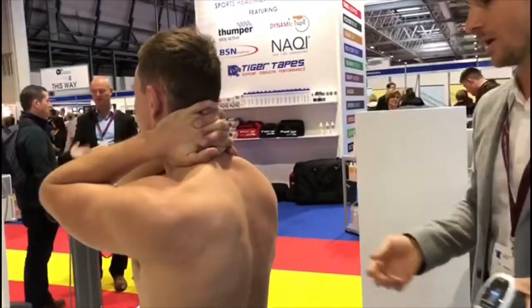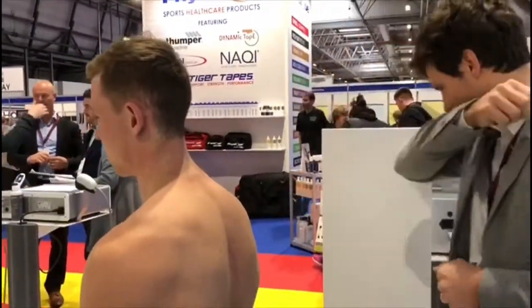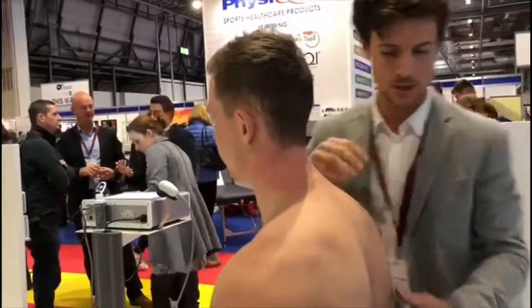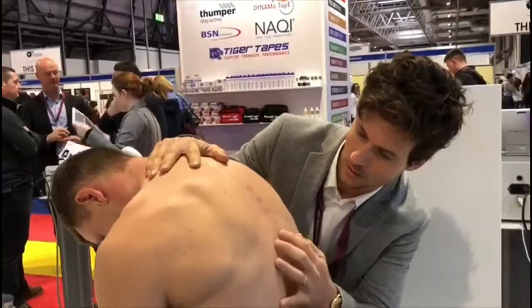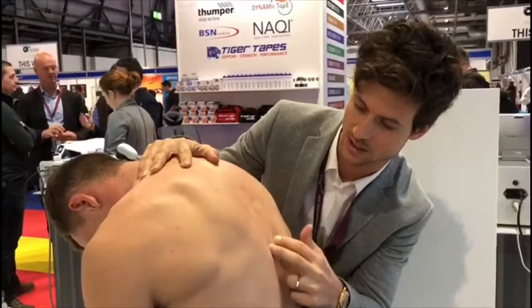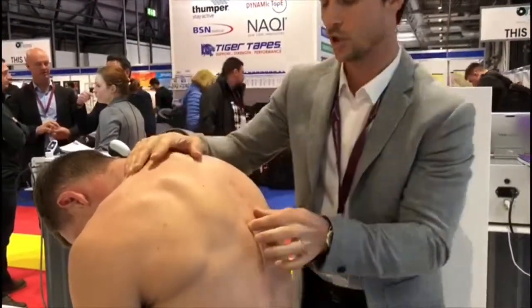So this is quite easy. It doesn't take a lot of time. Take down your arms. What we're aiming for is to get a reflexive response from the muscles around the joint, but also from the joint capsule itself, just to relax. Let's see if you flex now and see if we can get any more movement. So we've increased the movement. It's still a little bit stuck in this region, but I will try to treat a little bit more.